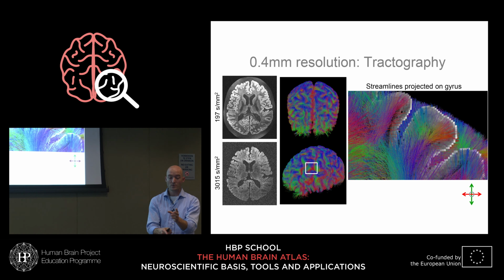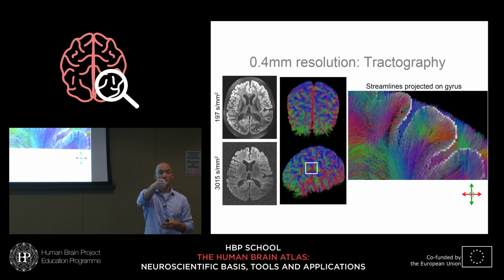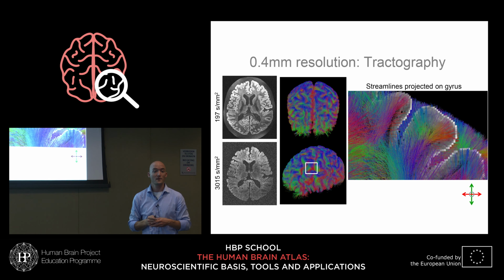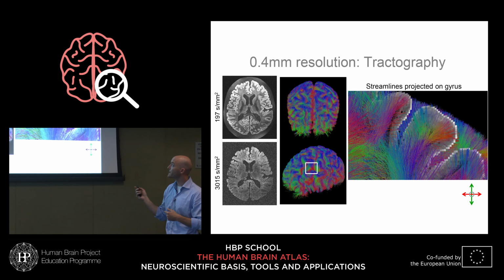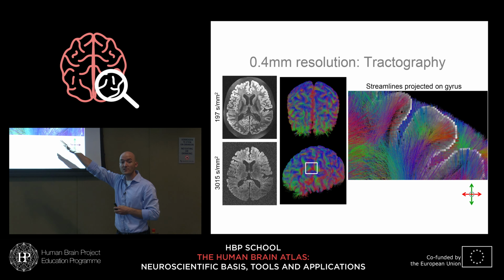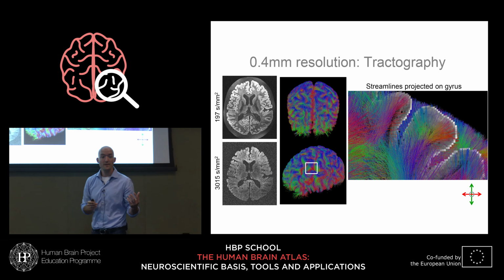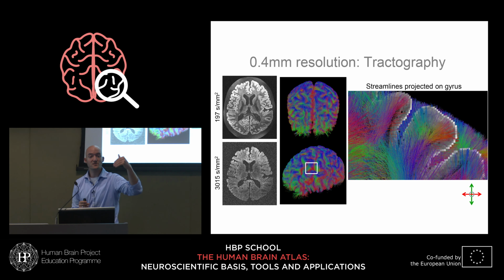So it will see radial diffusion all the way through cortex, and I'm about to show you a picture at even higher resolution on a smaller piece of tissue. But probably the tractography algorithm is going to follow the axon, go straight through the cell body, follow the apical dendrite all the way to layer 1, and so it's going to make you think everything is connected to layer 1, which is not true. So honestly, I think there's a lot that diffusion MRI at high resolution can tell us about whereabouts in a tangential sense certain fibers insert. I don't think it can tell you in which layer it stops, because there's nothing in the diffusion signal that can distinguish between where the axon ends and where the dendrite begins.